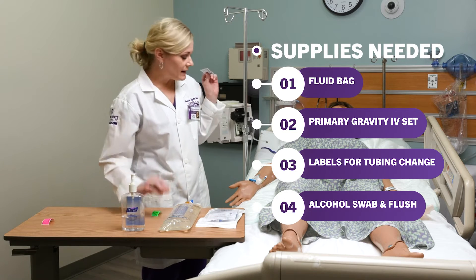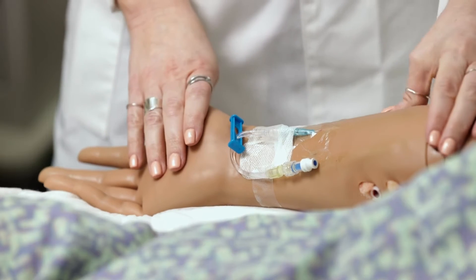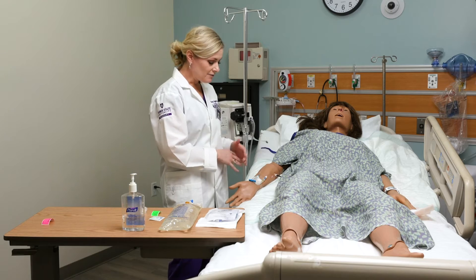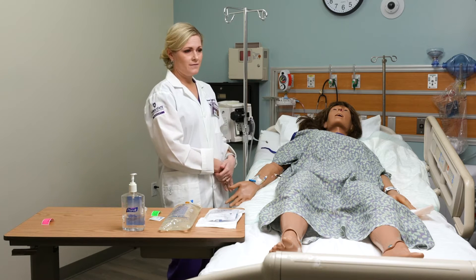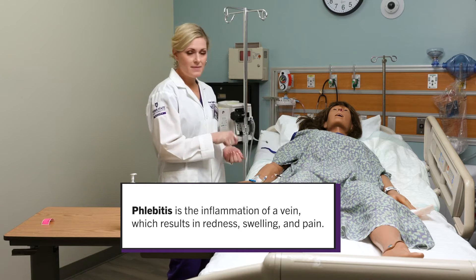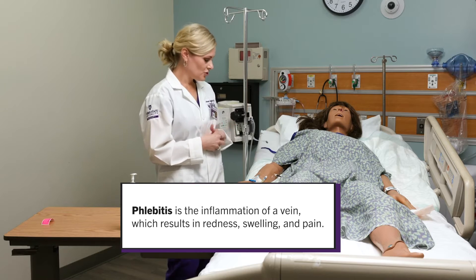I need an alcohol swab and then a flush to flush before I attach this to my patient. I want to check my IV site first and make sure it doesn't look inflamed or infiltrated, looking for signs and symptoms of phlebitis. When I flush it, I'm going to make sure it's patent and there's no infiltration.